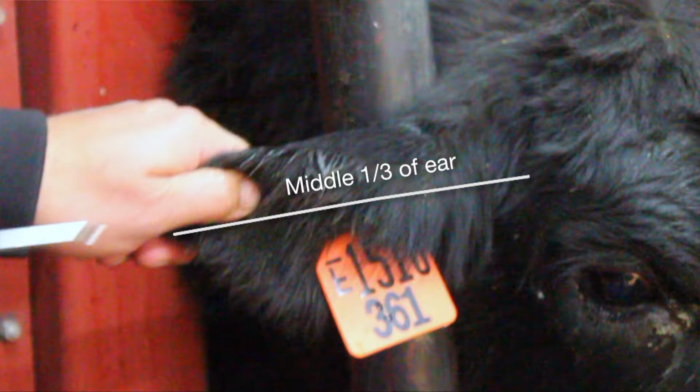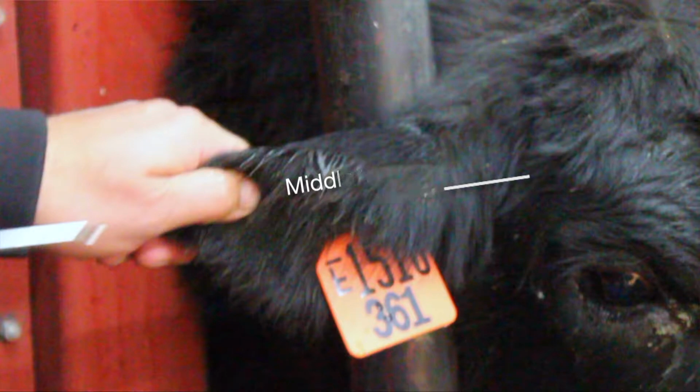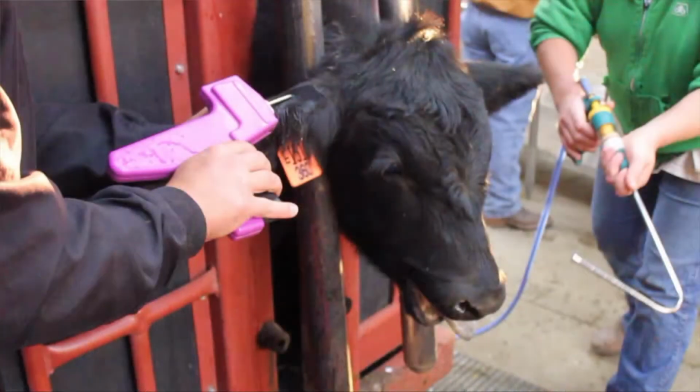Now, if you look at the ear, it also has multiple little valleys in it. We want that implant to end up in the central valley, down in the bottom, where it's protected and out of the way, and that's really our ultimate goal. But keep in mind, there may be ear tags, previous implants, or anything like that in close proximity to where we are trying to put our implant. So a good rule of thumb is to be a finger width away from whatever obstruction is there.